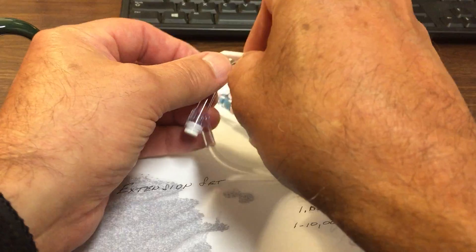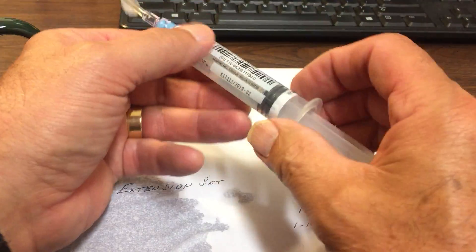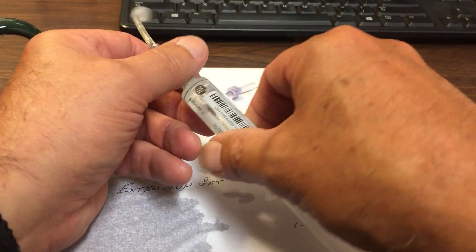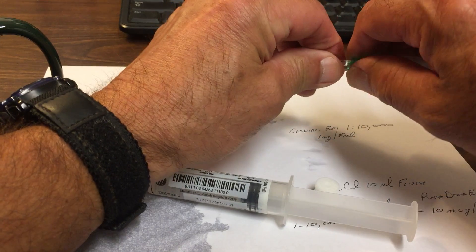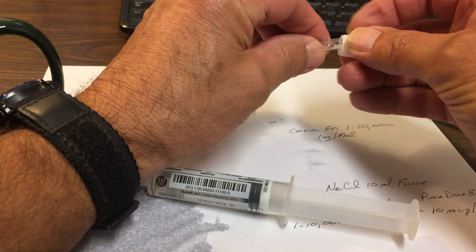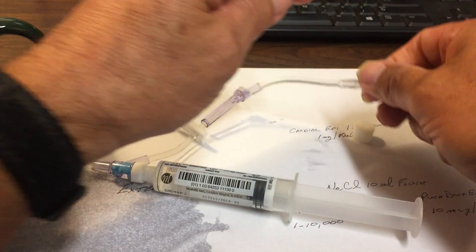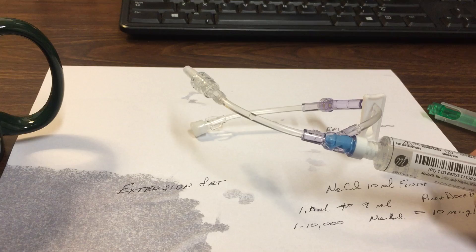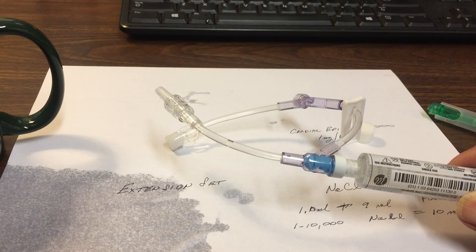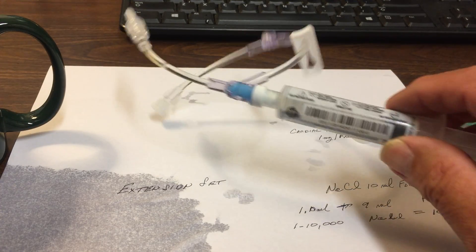Now we've got our solution, so I'm going to close this off. I have a vial now — I can shake this up a little bit to get that distributed well. I'm going to take this off, put this end on here, and we've got that capped off. We're ready to hook up to our IV port. We can use a needleless port, or we can put it right into the end of the line.